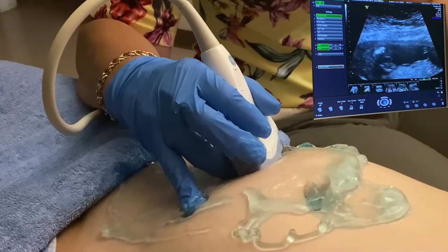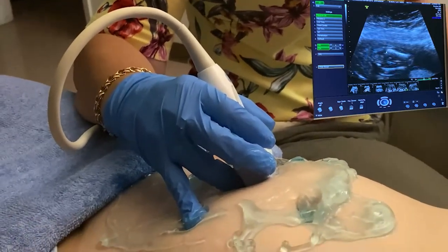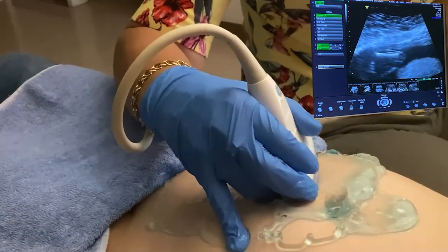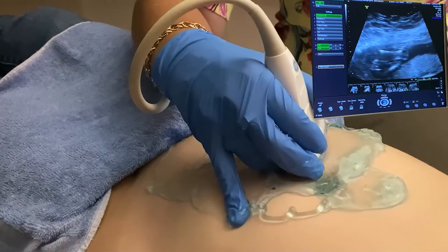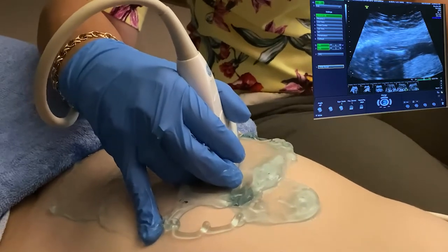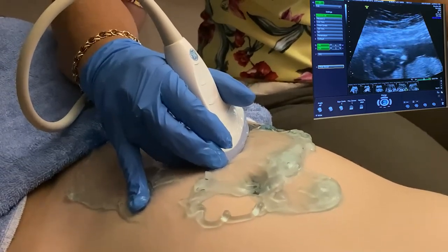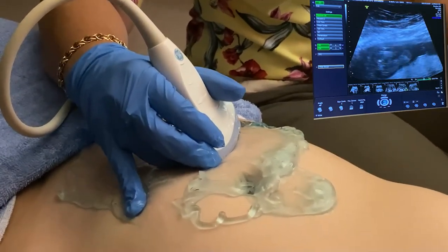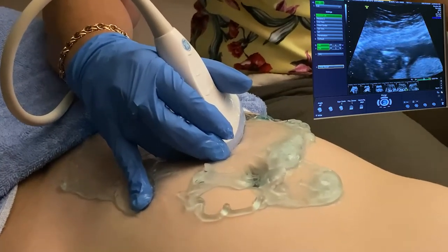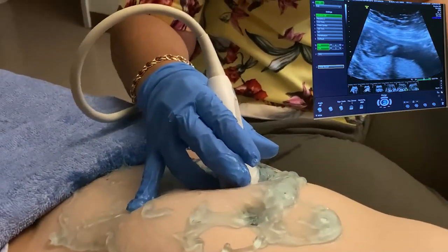Now the ala, the pelvic wing, will point to the femoral head. That's how you know. We're going to measure the most anterior femur, and we're just going to measure the shaft. We're going to exclude the epiphyseal edges and just measure the shaft. Now, I want you to measure it when it's 100% as best you can, perpendicular to the ultrasound as it isonates against that bone.